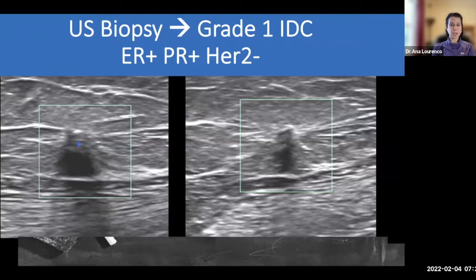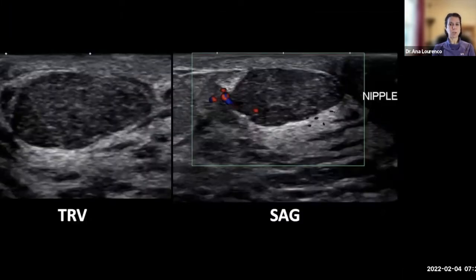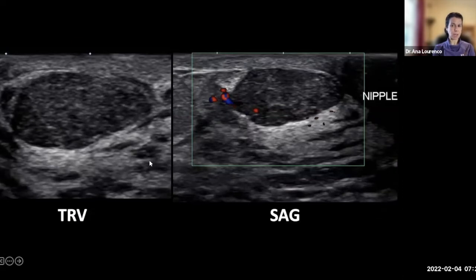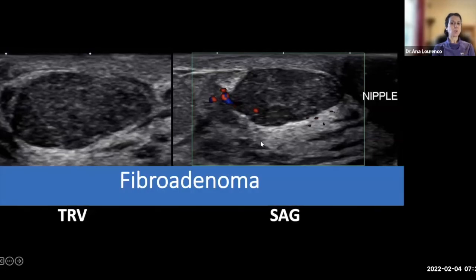Next case: a 25-year-old with a palpable left breast mass. On ultrasound there's an oval hypoechoic solid mass with slightly increased through transmission of sound, parallel to the chest wall, pretty circumscribed margins, and a little internal vascularity. This one indeed was a fibroadenoma — looks like a duck, quacks like a duck. That's what it was.